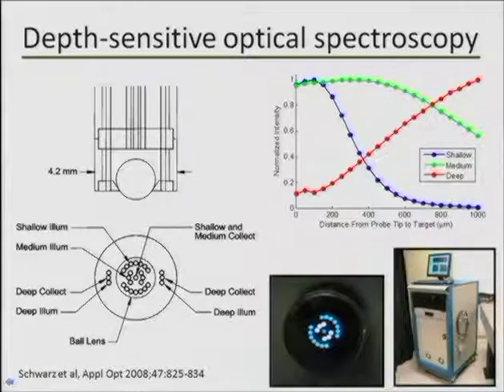Once again, the small compact instrument that you saw was preceded by a larger instrument that measured many, many different excitation wavelengths and parameters, and that was the instrument shown here, which I'm sure Christina remembers well.